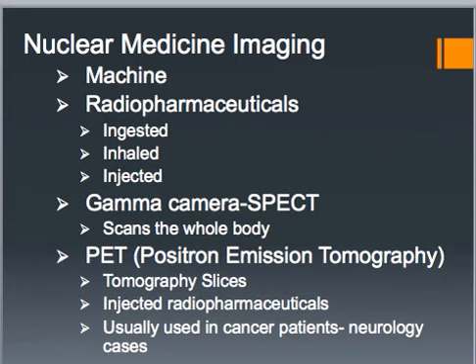You can inhale it. It's like a gas that you inhale. It doesn't even really smell like anything. It doesn't affect your sense of smell or anything like that, but we use those sometimes when we're scanning the lungs to try to see how it goes through the airways. And then also it can be injected through an IV, an intravenous injection, which is the most common one. I've had a nuclear medicine scan before. I've had a bone scan, and they did inject the radiopharmaceuticals into me for the scan.